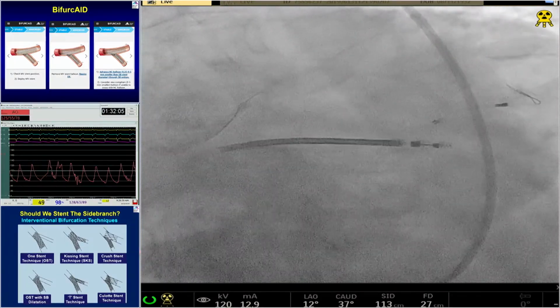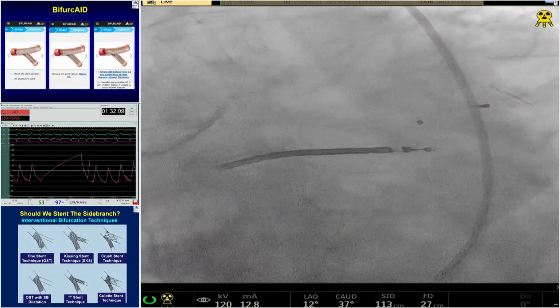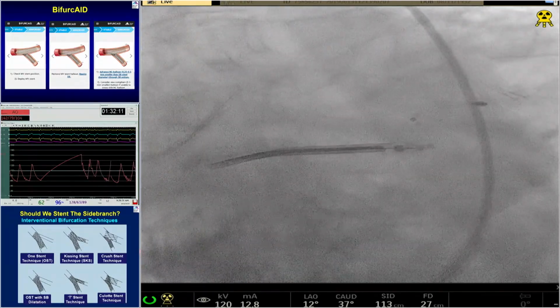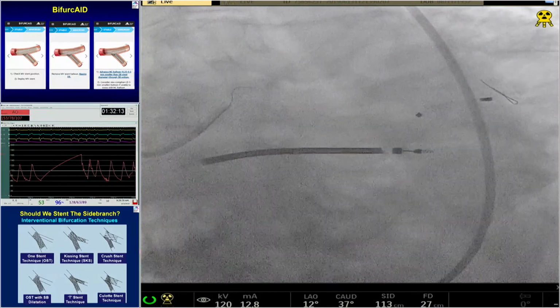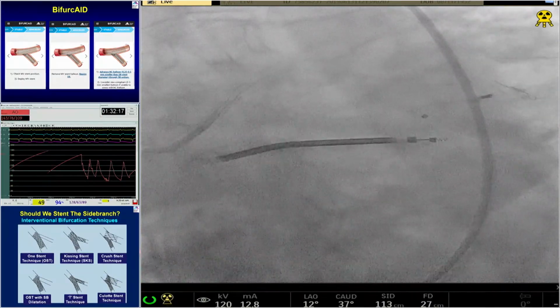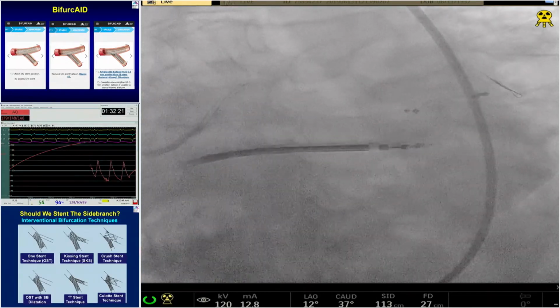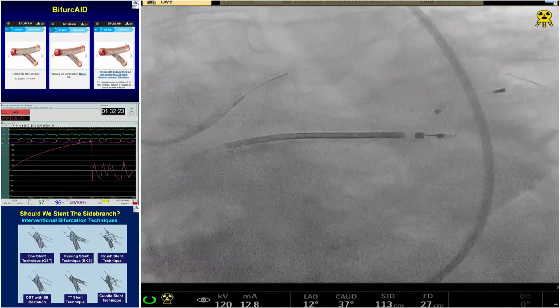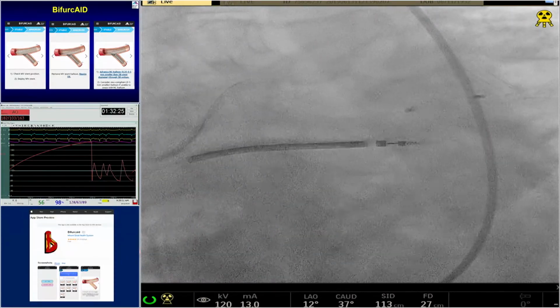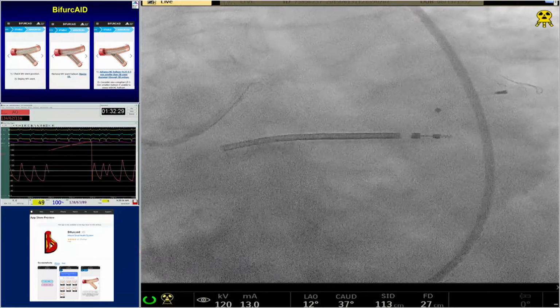We are not doing routine angiographic follow-up, but I can tell you that in our database, these bifurcation 2 stents are not restenosing at a 50% rate. Dr. Sharma, do you want to comment on that? This is what Dr. Colombo and Yves Louvard are saying, that you change the geometry with 2 stents, and later there will eventually be restenosis there.